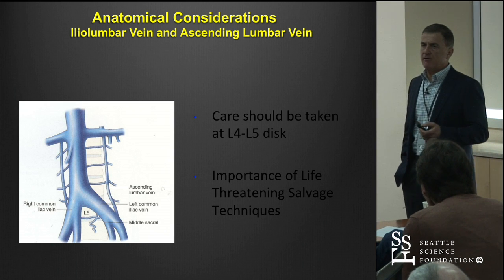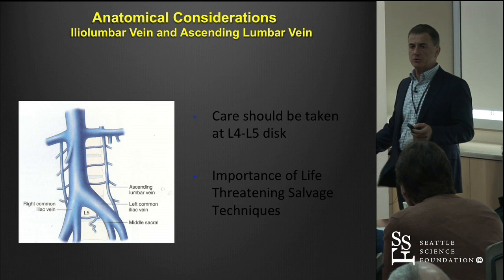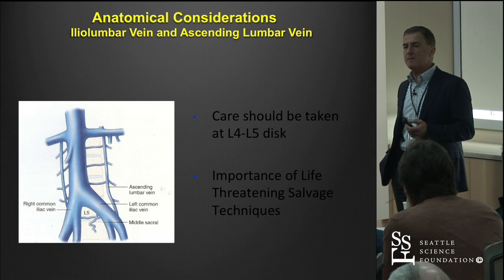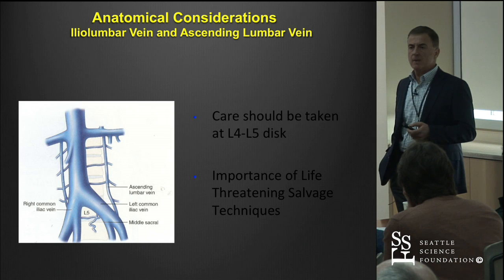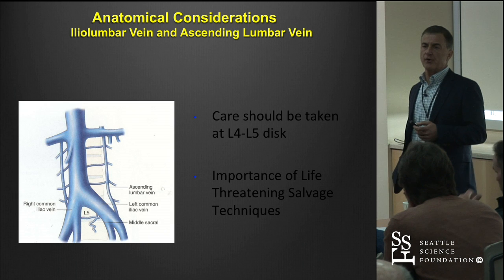You have to have a plan in your mind that if I got a vascular injury, now granted, it's really rare, but if you have a vascular injury, you have to have a plan. What am I going to do if I got an injury? Am I going to extend the incision, apply pressure, call the vascular surgeon in? Am I going to apply Floseal, let it stop, and then go to the radiology suite?